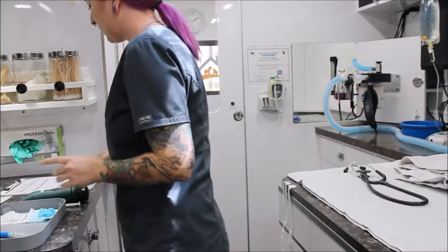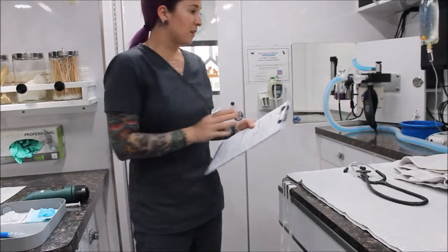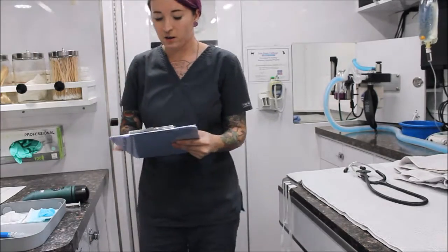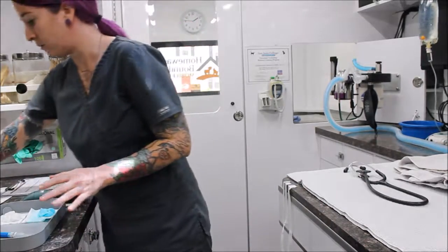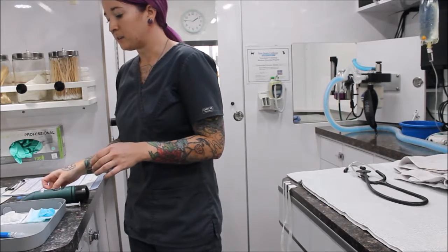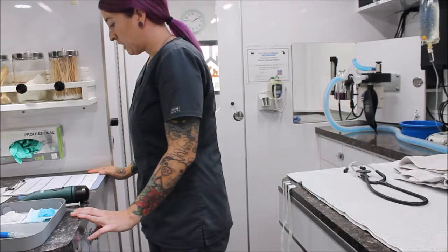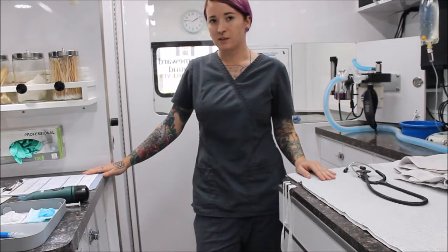And then finally, the last thing I'm going to do is just confirm that I have everything together and everything looks okay on his anesthesia log here. And I am going to just make sure that I have his propofol dose ready to go, and it is near the induction area as well, just for the doctor to be able to have easy access to it. And that is how you prepare all your equipment and supplies prior to anesthetic induction.